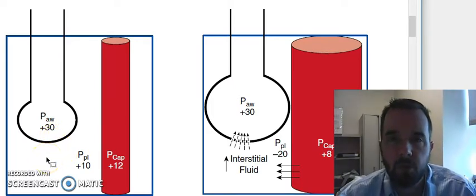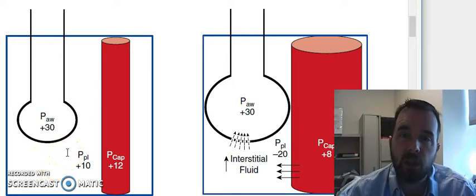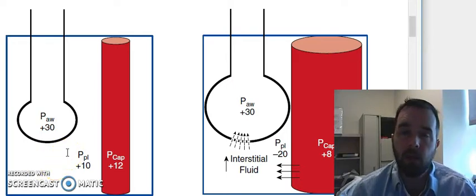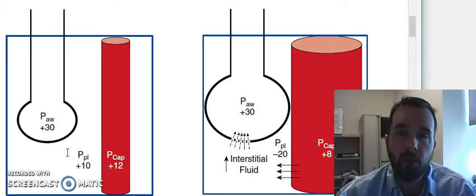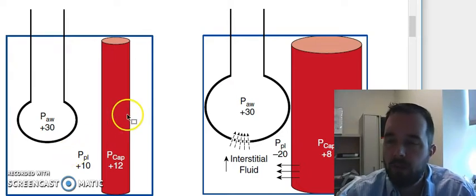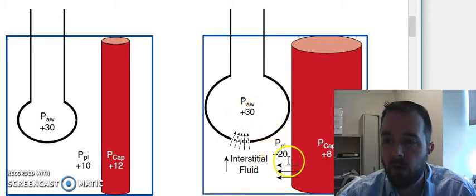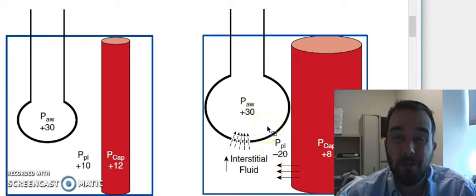When someone's on positive pressure ventilation and, in addition to getting air blown into their lungs, they take a breath in at the same time, like on a breath over the set rate, so they trigger a breath, and if they're wide awake and take a deep breath, we have to be careful because that positive airway pressure is going to combine with a negative pleural pressure now, such that the transpulmonary pressure is 50. So you can get really, really high tidal volumes, and that can cause volume trauma and lead to some lung damage.